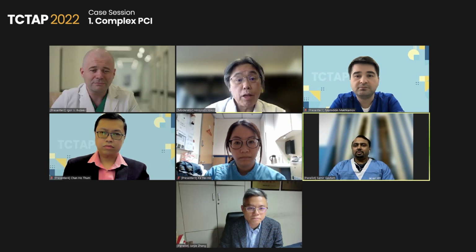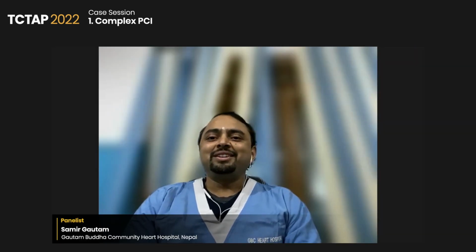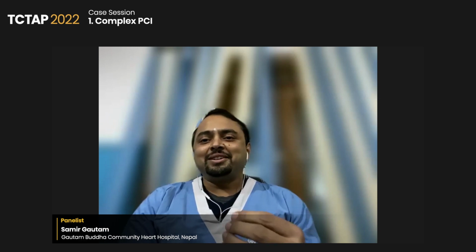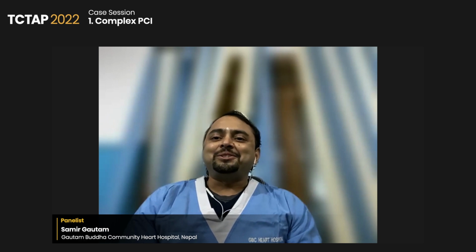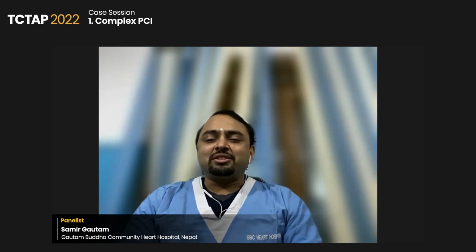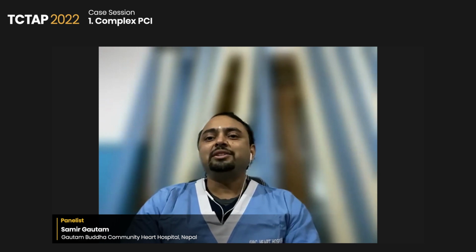So, other comments? Yeah, just a comment. I think this technology can help as a complement to support good decisions, and that will be very crucial for the patient, because we cannot have complications as far as feasible. We have to minimize them, and I think that this modality might be helpful in the future. I think when the cases increase, we'll know the exact advantage, whether it's really advantageous or just part of the use of newer technology only.